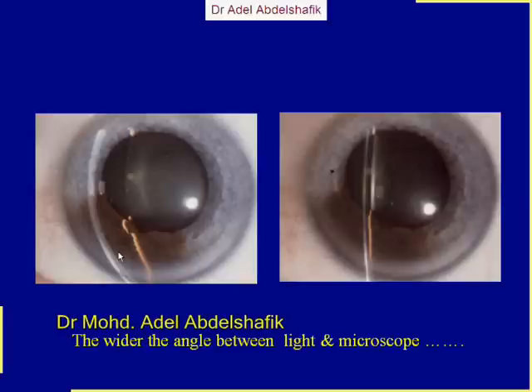Heterochromia. Okay, it's apparent in either image. Yes, there is some elevation here. See the light and it's getting up. So there is an elevation here. You don't see it here.